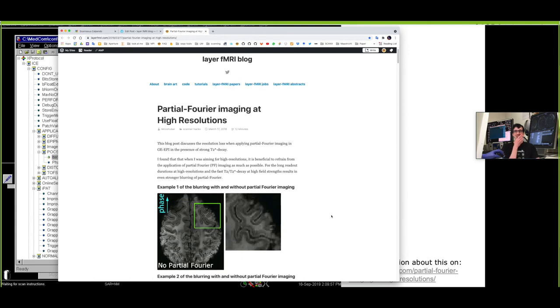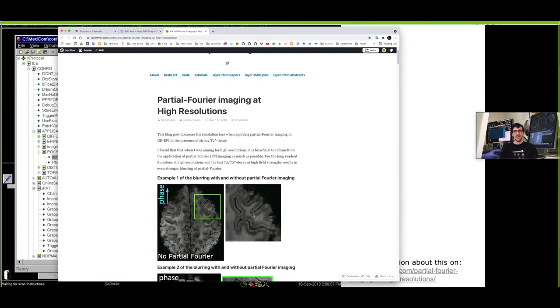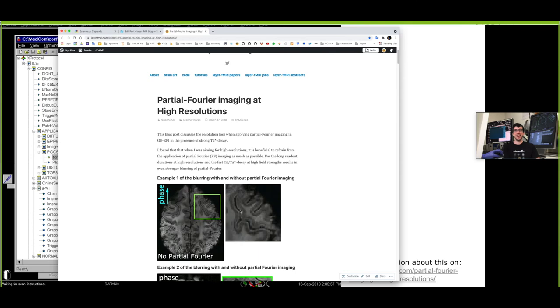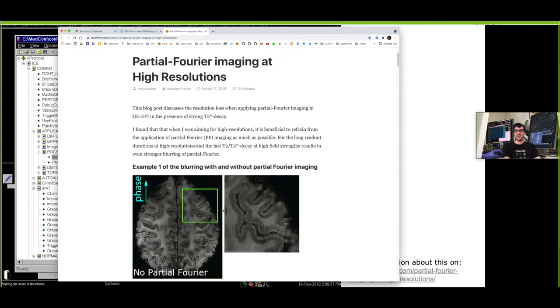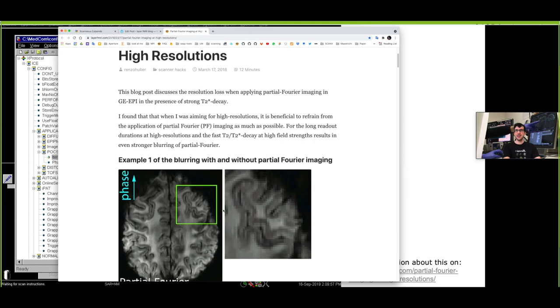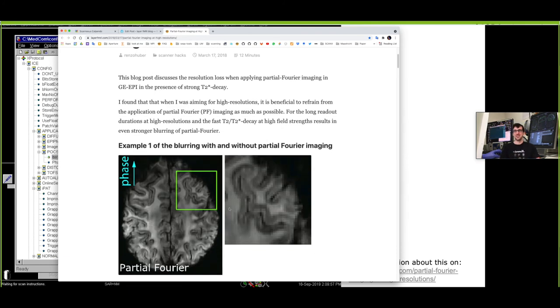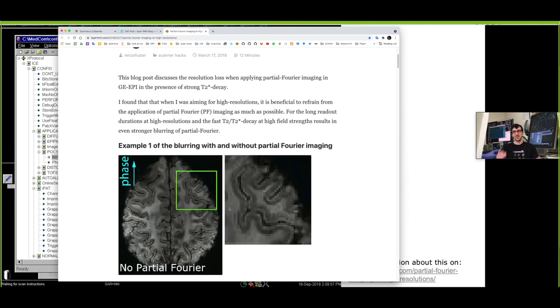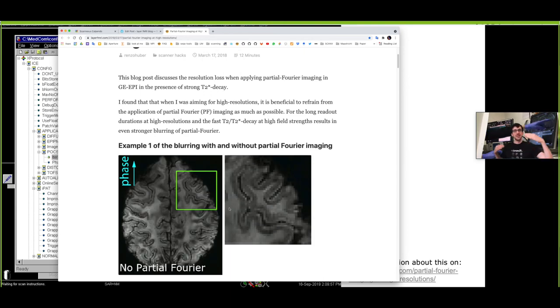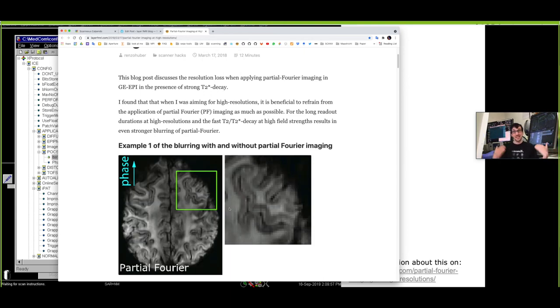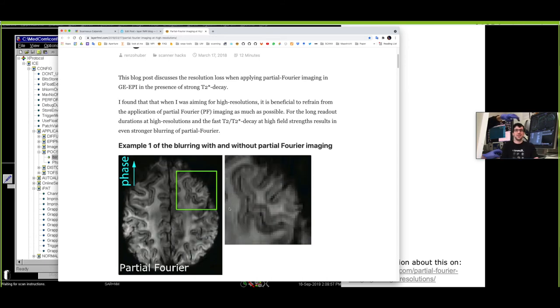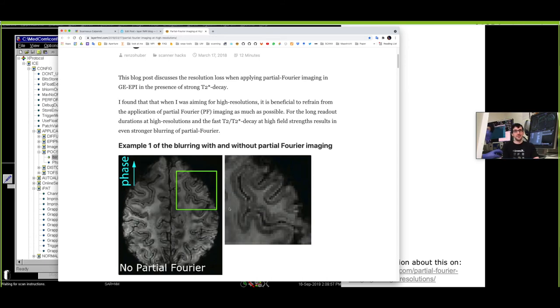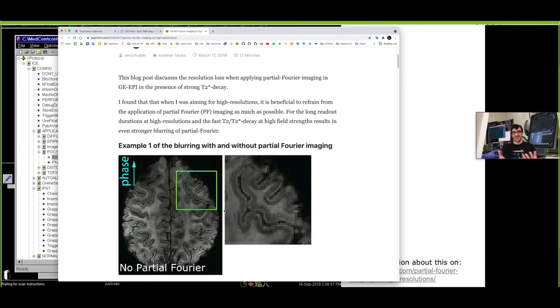Sometimes in layer dependent fMRI, here you can see how I'm switching back and forth between a partial Fourier imaging at five eighths, so rather liberal, versus no partial Fourier also without any GRAPPA acceleration. This is an extreme case with a large matrix size that takes quite a long time. You can directly see how partial Fourier imaging really improves the SNR. However, it's quite blurry.